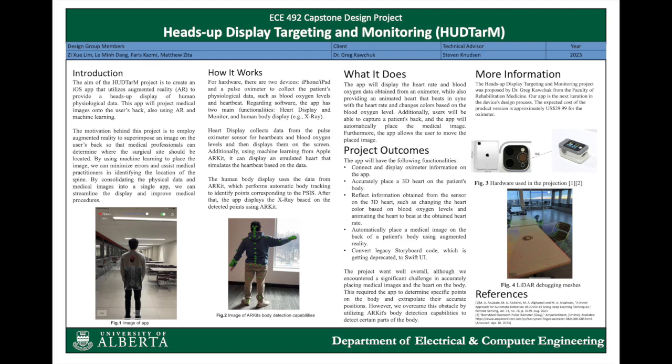We were able to meet the above expectations, but we were not able to get the detailed specifications correctly. For example, we wanted to have models accurate to 1 millimeter for usage in the medical field, but we were not able to meet that.